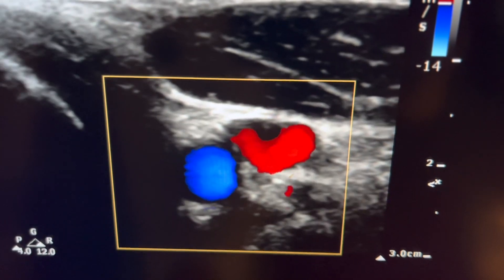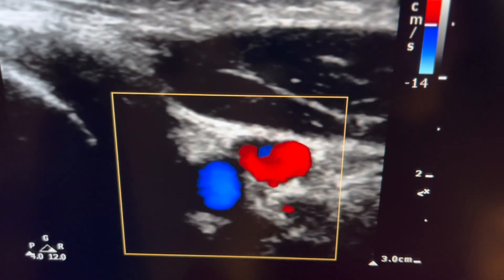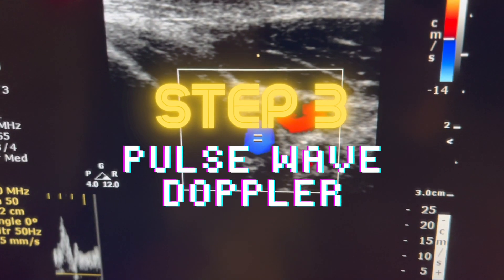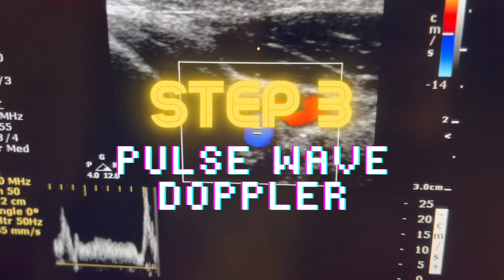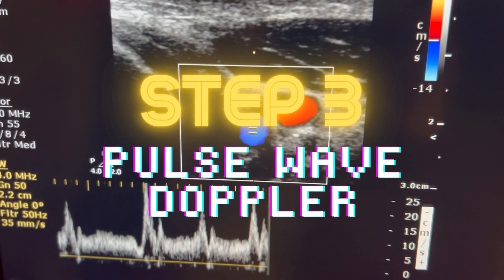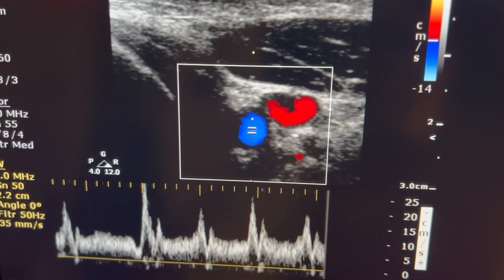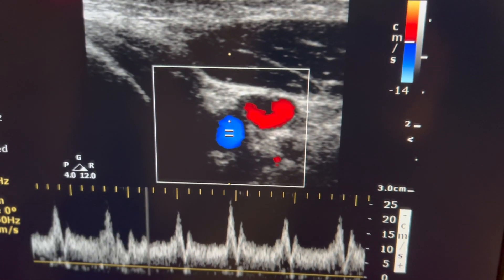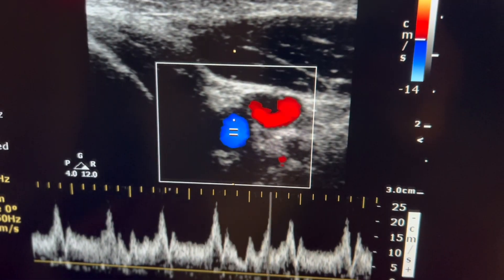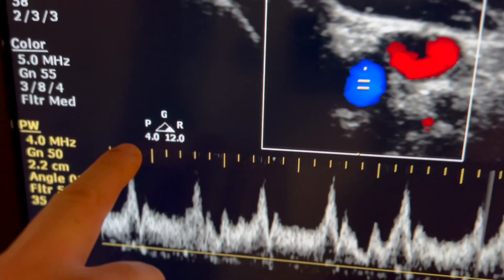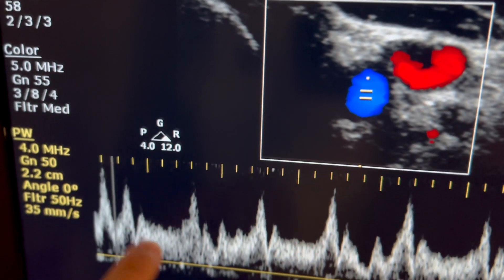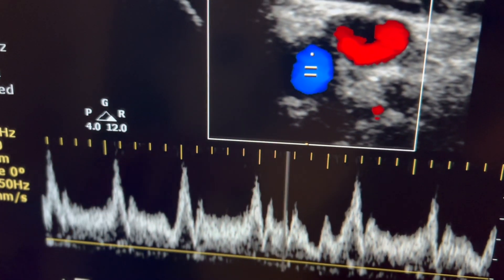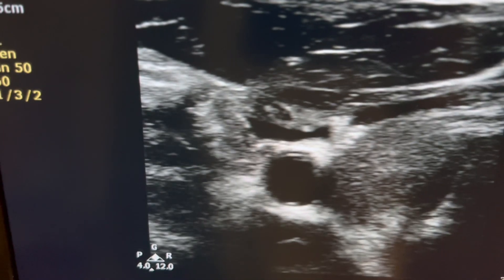The next step is to take a look at pulse wave Doppler to help characterize the flow in these vessels. You can clearly see pulsatile flow of an arterial waveform — the systolic peak, followed by the systolic decline, and then the diastolic flow.